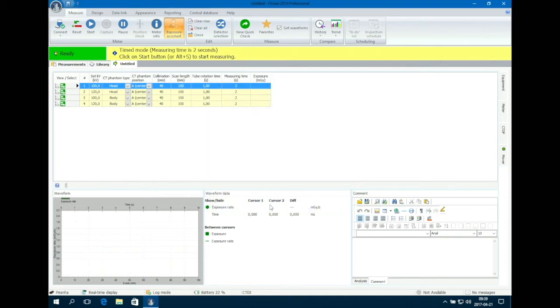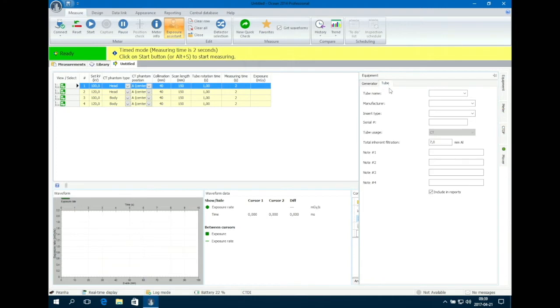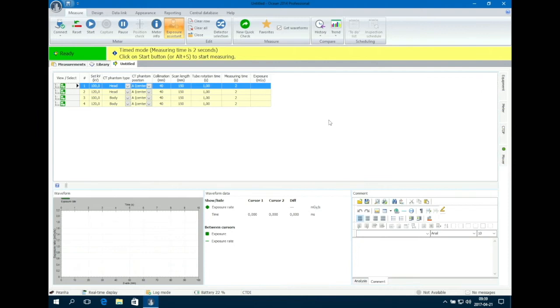These steps are done to help Ocean to extract all the measured parameters out of just one exposure. If you know the total inherent filtration you can add that too. Otherwise you can use Ocean's default value of 7mm of aluminium. You change this value under the tab tube. Close the equipment tab.